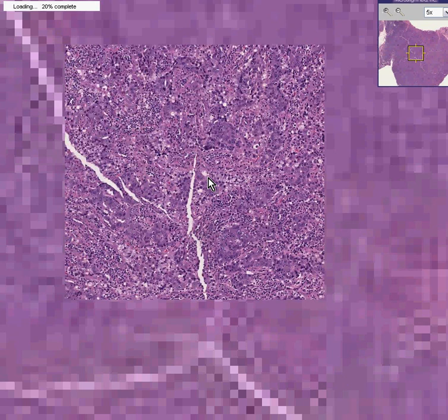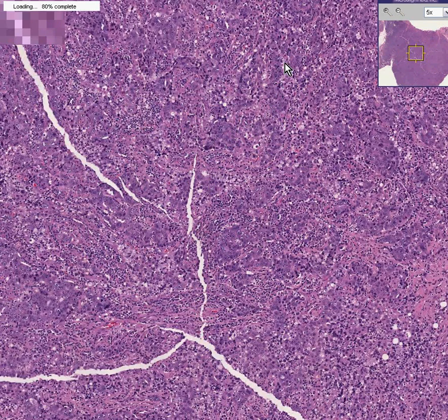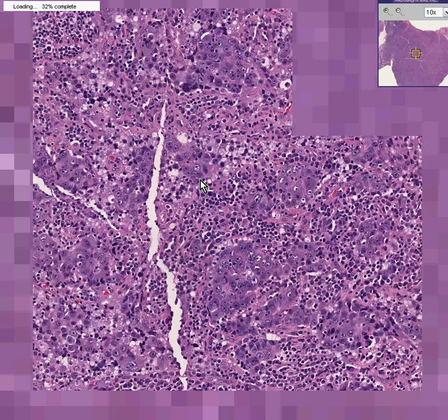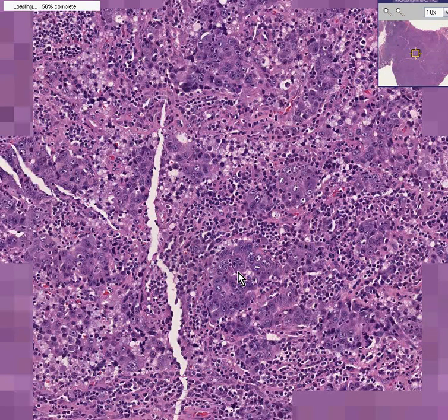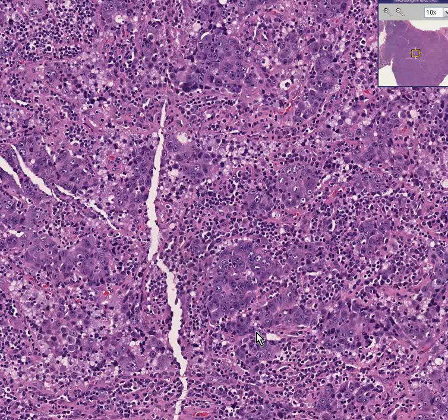But now when you go higher, you could see some irregular, perhaps epithelial-looking glandular structures here, here, here, here, here, and even really throughout the whole area, in which you're wondering if these are infiltrating glandular elements. In addition, these glandular or epithelial areas, even though they are surrounded by a very abundant amount of lymphocytes, they look as malignant as all hell.